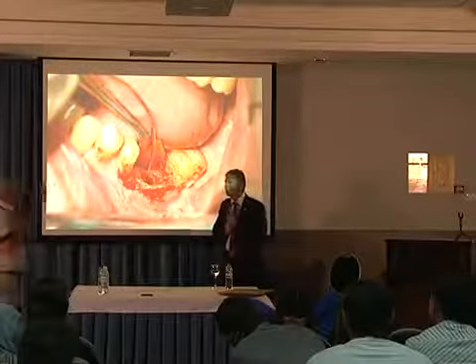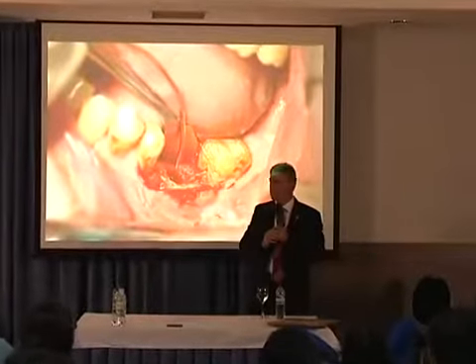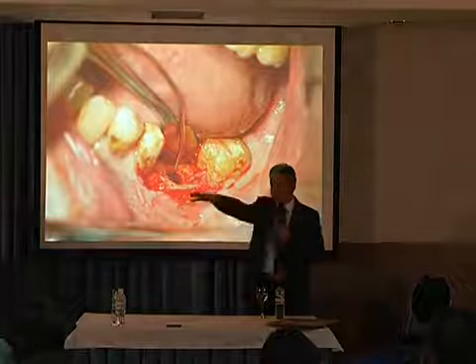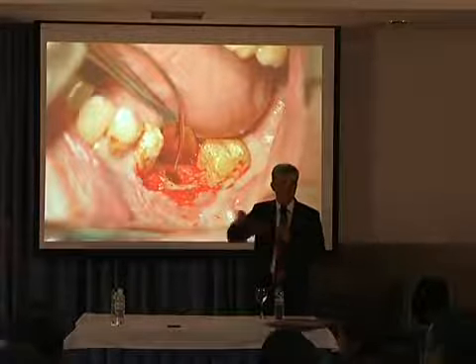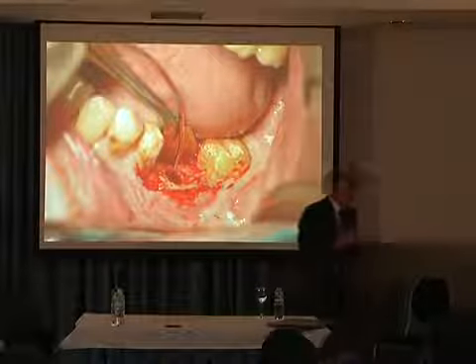Yes, the probe with the ball on it, the Baumann probe. A ball probe. If anybody does not have it, if Mr. Kreuzler does not have it, please go to the stand and buy such probes. Just a few euros for that, but very, very helpful.